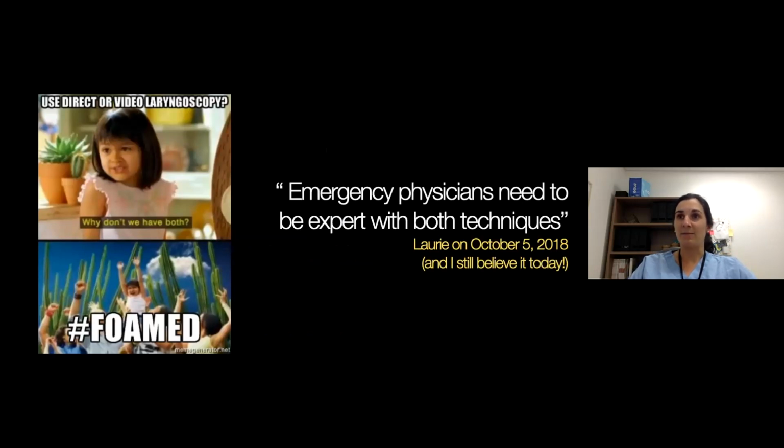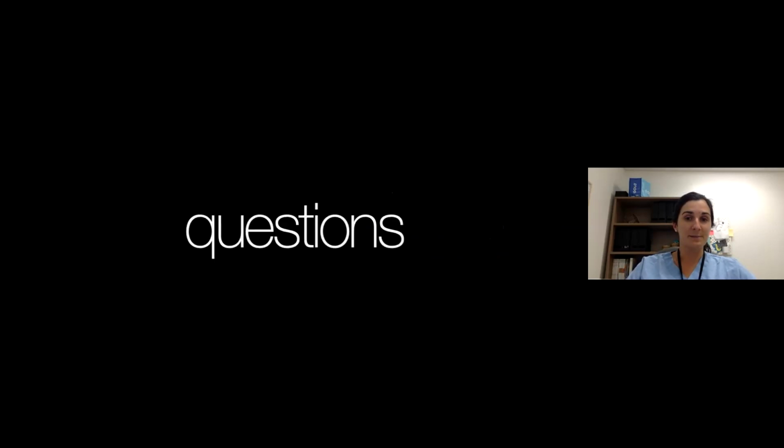Sometimes in certain hospitals, let's say, Valleyfield, where I work, you'll be called for a code on the floor. You don't have Glidescope on the floors. So when you decide to intubate a patient because there's a crashing airway, or they're in cardiac arrest and you're there in your sequence that you need to intubate, there's no Glidescope. So you need to be comfortable intubating with direct laryngoscope.